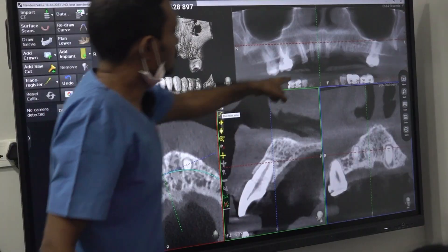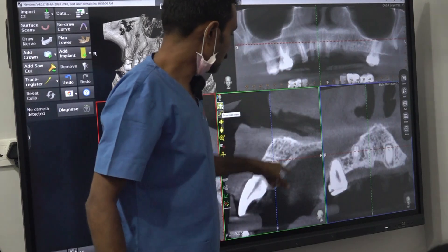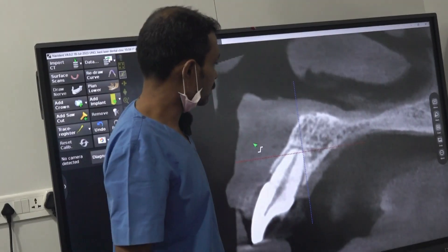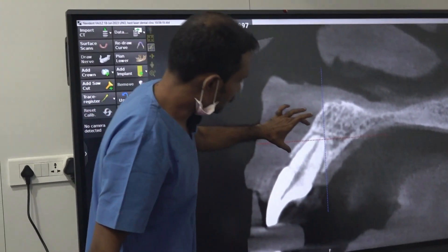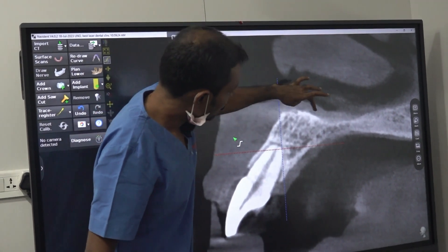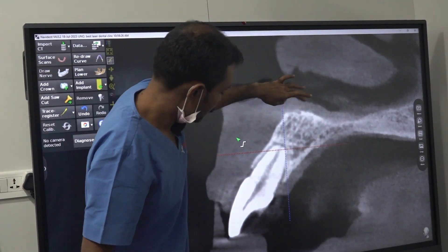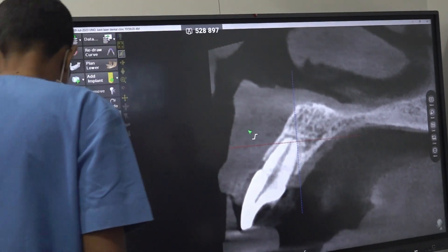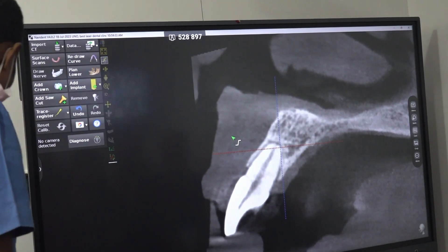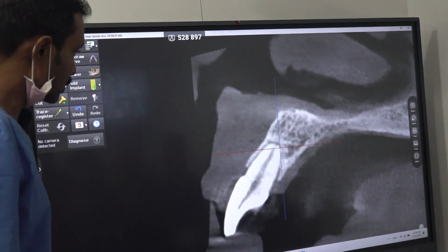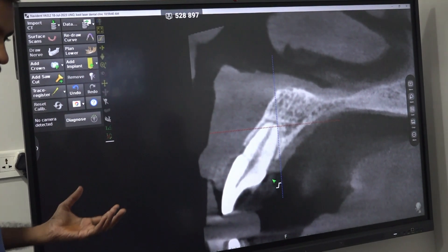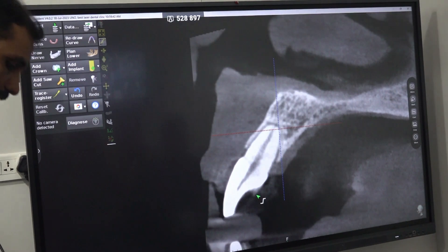Buccolingually, this is how it looks. The green line is the 1-1 buccolingual cross-section. You can see the root resorption. This is the alveolar part, this is the basal bone, this is the nasal floor. Now if you see, these are the HU units — wherever the mouse goes it will tell the HU units, how much density it will show.